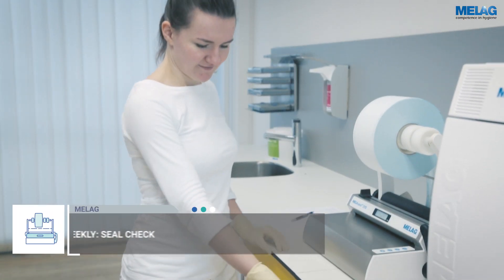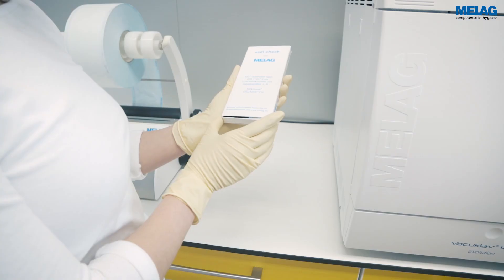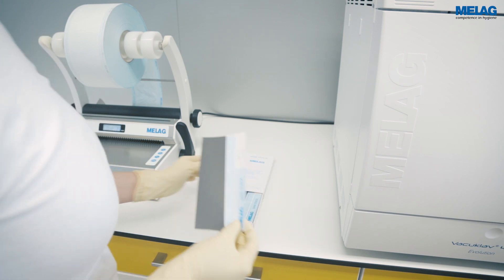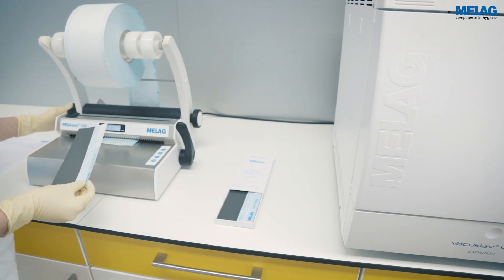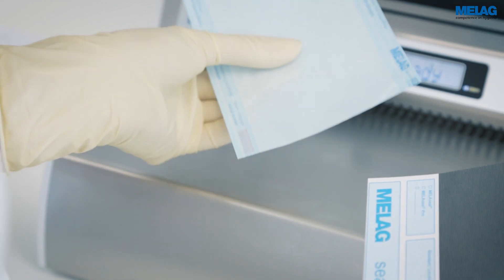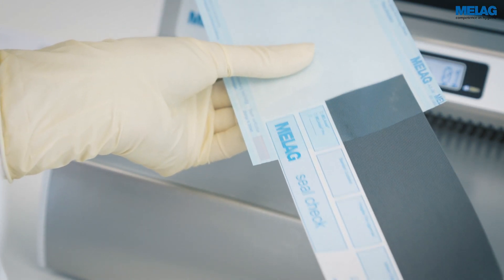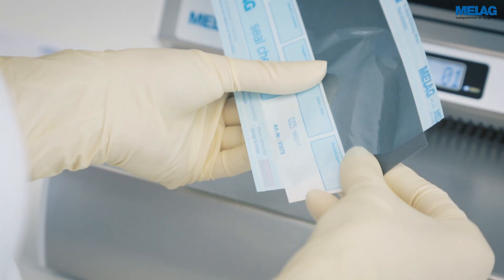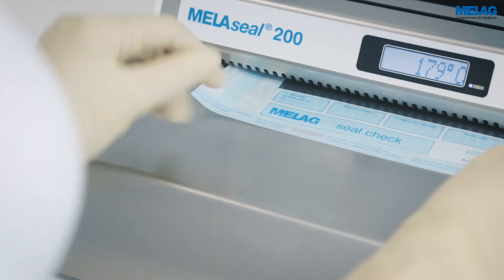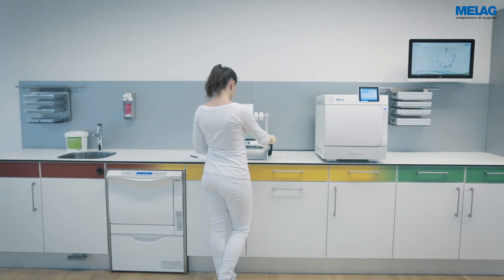Moreover, control the entire sealing area using the MieleG seal check on a weekly basis. Please insert the seal check in the sterilization packaging so that the grey test field is visible through the transparent foil. Slide the sterilization packaging into the sealing device with the foil side pointing upwards. Make sure that the seal seam generated runs centrally across the entire test field.